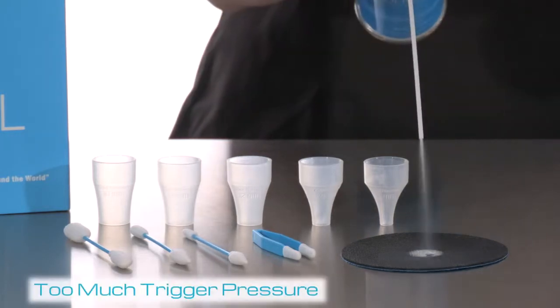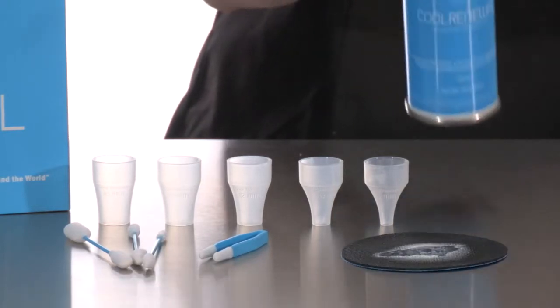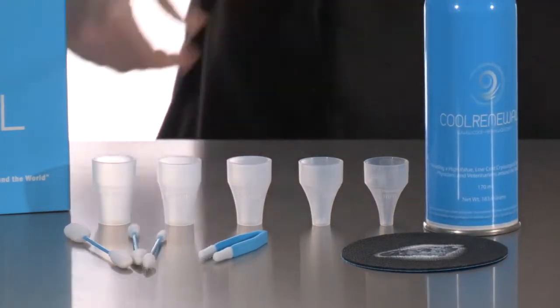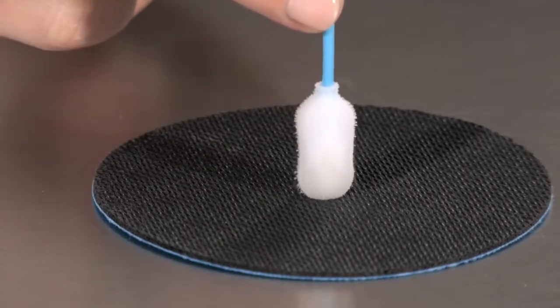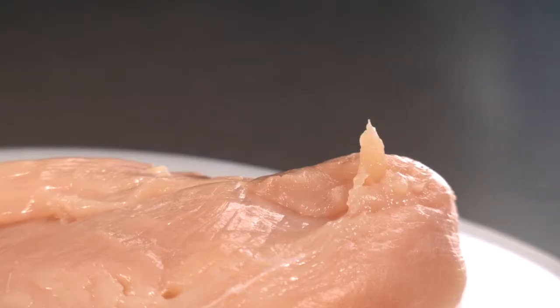Always use gentle pressure on the trigger to avoid blasting. This will conserve your cryogen and reduce any splatter during application. An applicator practice pad is provided for training prior to actual patient treatment. Raw meat may also be used to simulate treatment.